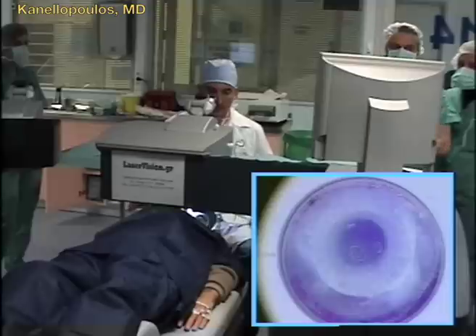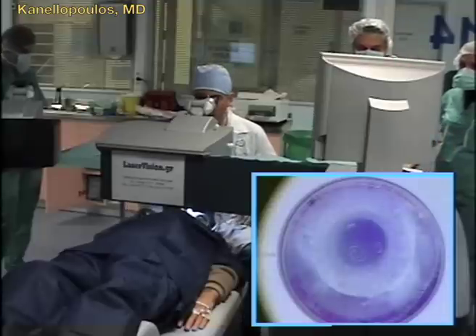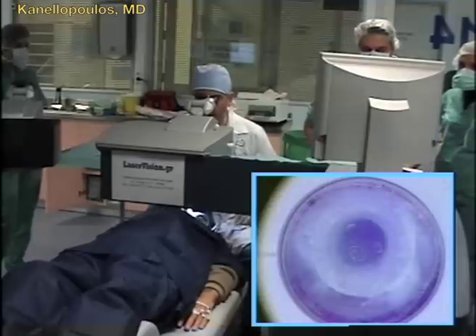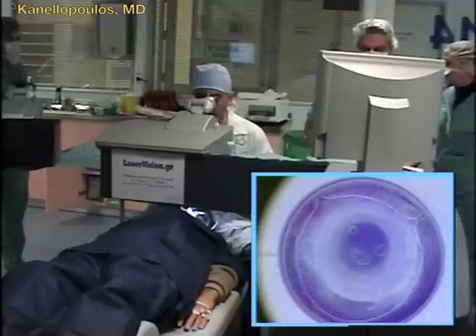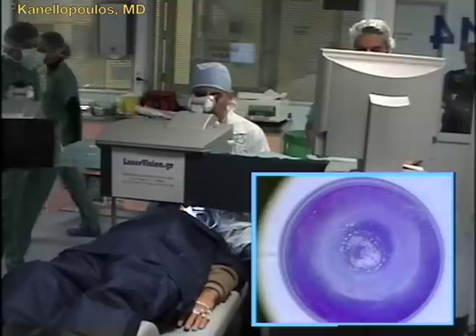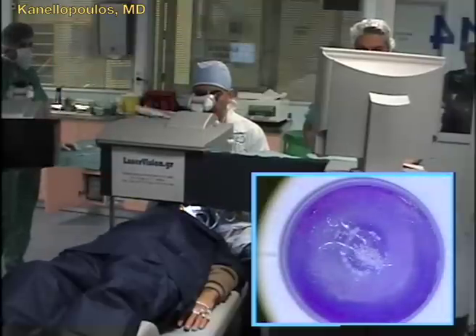The actual trefination time of the host is not being edited. As you can see, the patient is very comfortable. The actual patient interface is single-use.